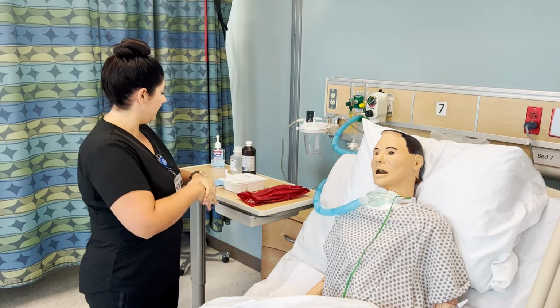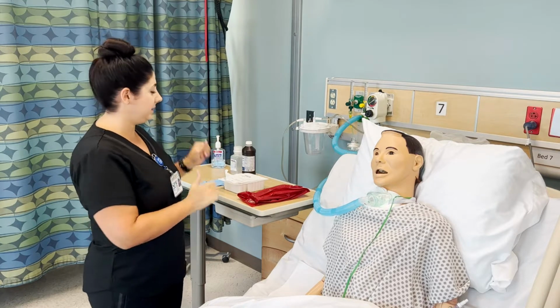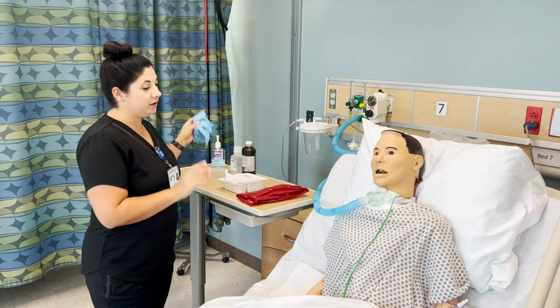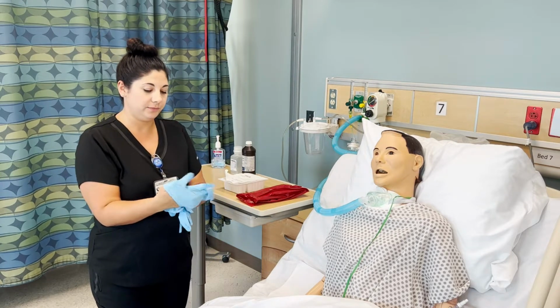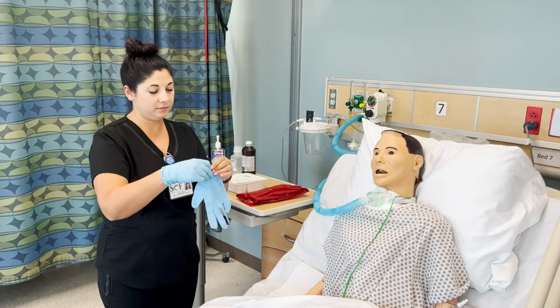I have my trach care tray, hydrogen peroxide, and saline. I also have a biohazard bag. If your dressing has any blood on it, you want to put it in the biohazard. Otherwise, it can go in the regular trash. We'll go ahead and put gloves on.